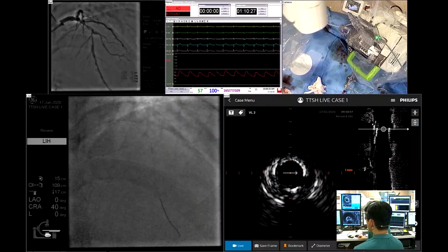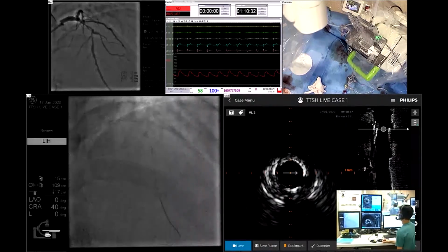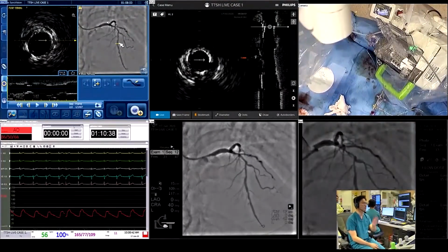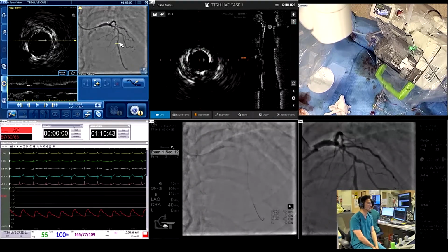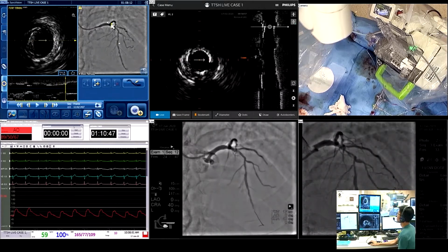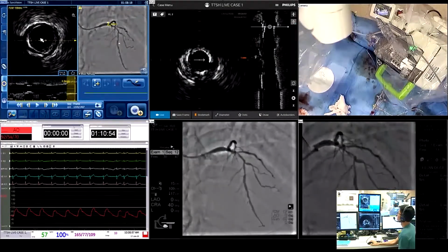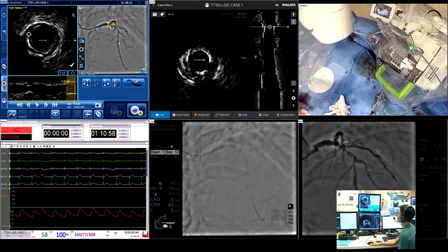Okay, so can you see the co-registration now? I'll see if I can give it to you. I will have my co-registration here. Okay, so you see the co-registration, the top 2 screens, right? You can see where the arrow is pointing. So Tony, can you move it back more proximally and find a good landing zone for me? Okay, so this is probably where I want to go. Okay, here is good. We bookmark here, let's say.